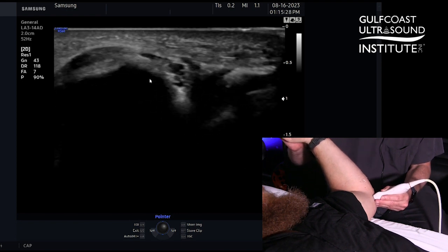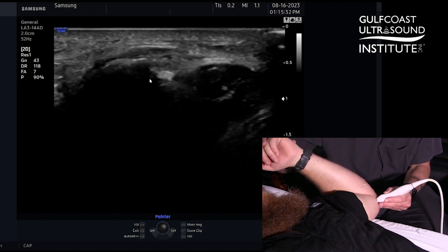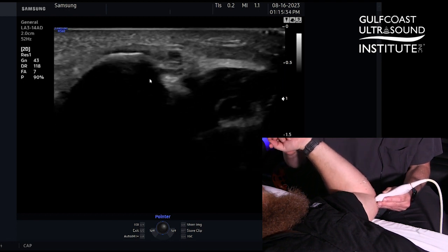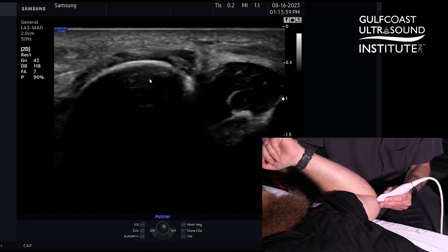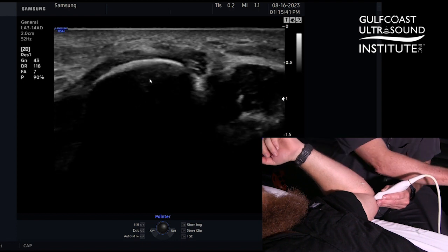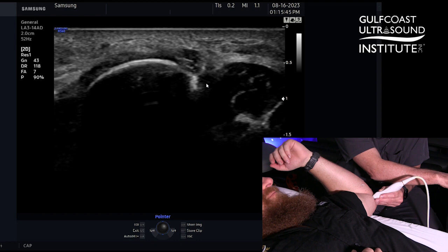As I start to flex, we're going to see some movement here. I try to keep my position on the medial epicondyle, and we can see there's a little bit of subluxation of that ulnar nerve on the medial epicondyle. You can move back and forth. To this side is the medial triceps muscle, and that can create some compression on the nerve as well.